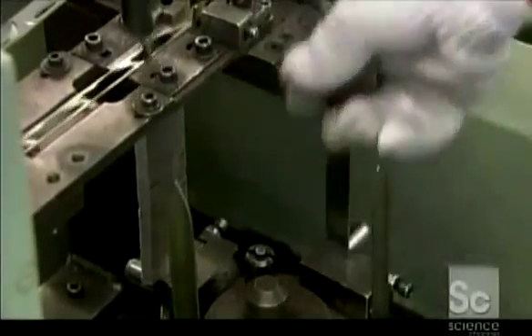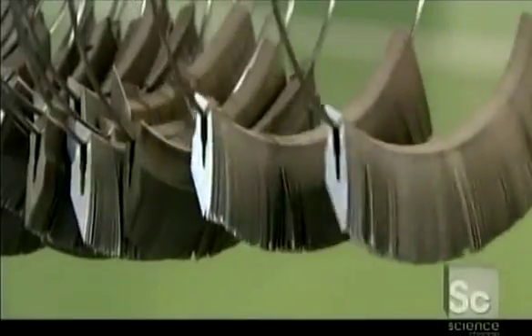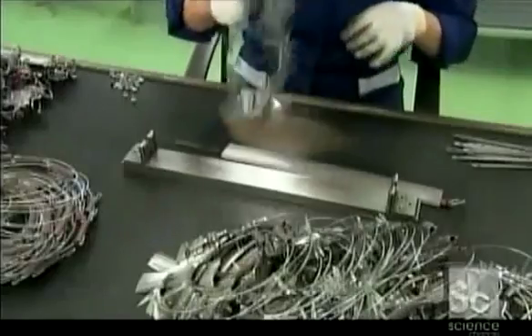A worker threads a metal ring through the slots to keep them together, then sends the whole set of blanks for surface polishing. This process will restore the metal's original sheen, which was dulled by the heat treatment.